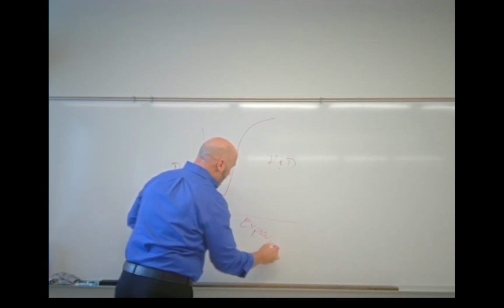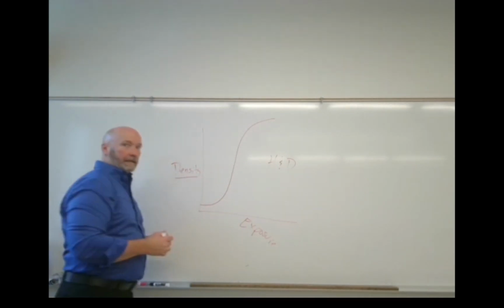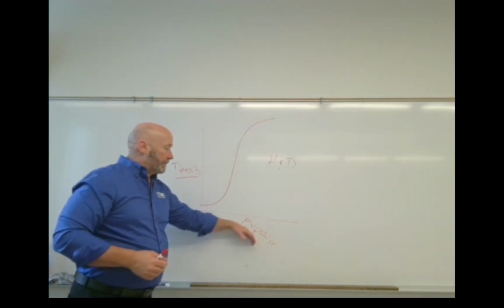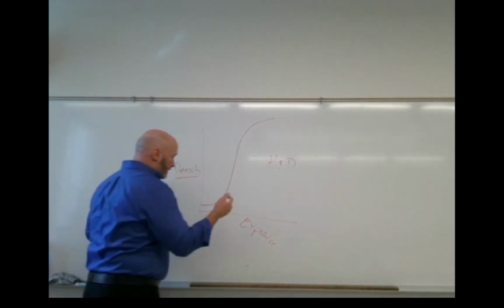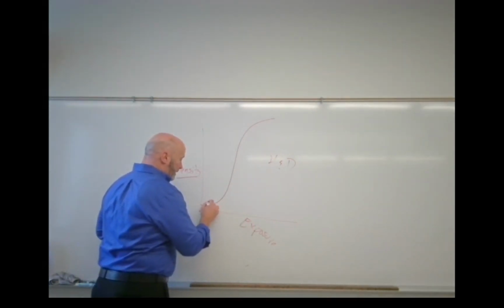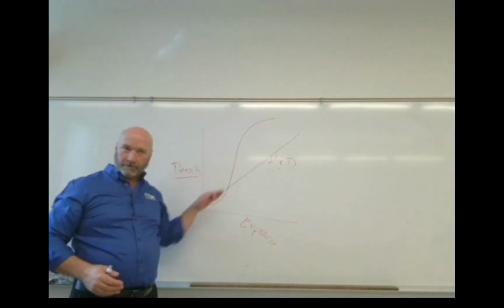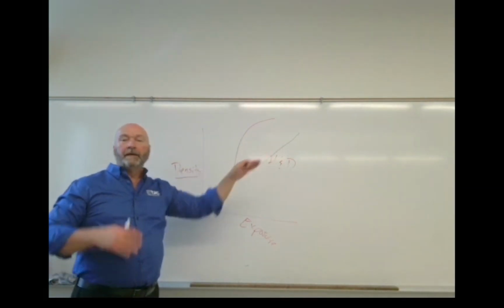As you would expect, if you increase your exposure, you get an increase in density, right? You would think that there would be a direct relationship between exposure and density, and it really wasn't. If you had a direct relationship, then for every unit of exposure, your unit of density would go up exactly the same, and what you would have is not a slope, but just a line that goes from minimum density to maximum density at a constant rate at a 45-degree angle.